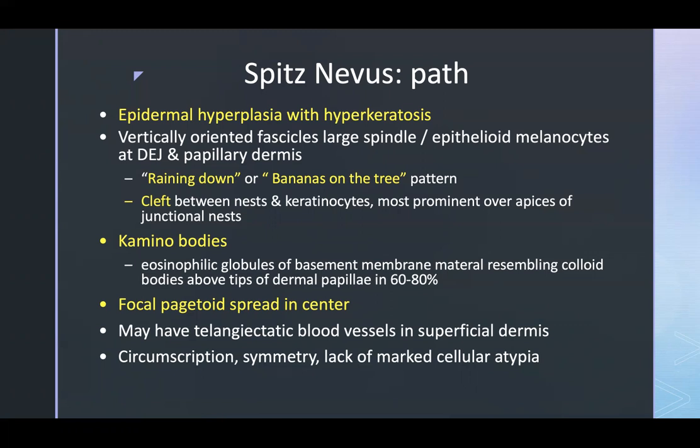So you can have spitzoid melanoma in young kids, and that's the thing that you don't want to do is diagnose something as a Spitz nevus, when in reality it was a more malignant behaving spitzoid tumor, atypical spitzoid tumor, or a spitzoid melanoma. So we have several key immunohistochemical stains we do to work these up, in addition to the H&E architecture assessment and the cytology assessment.